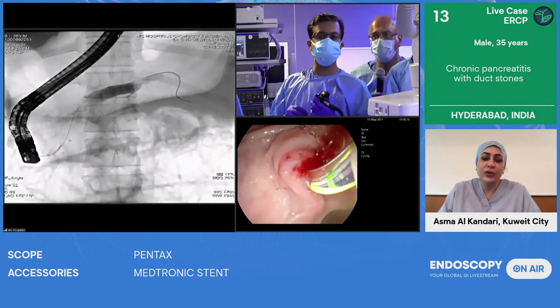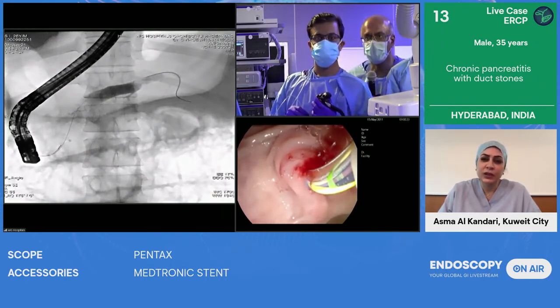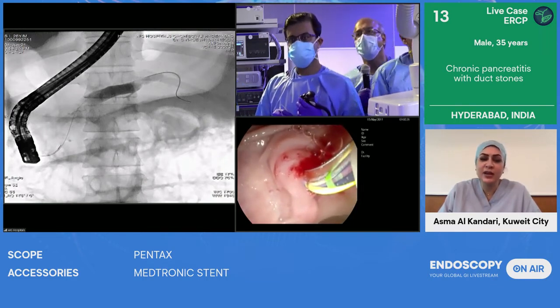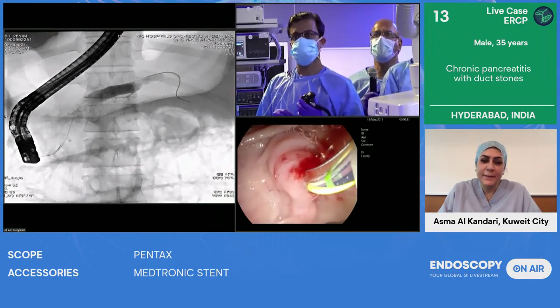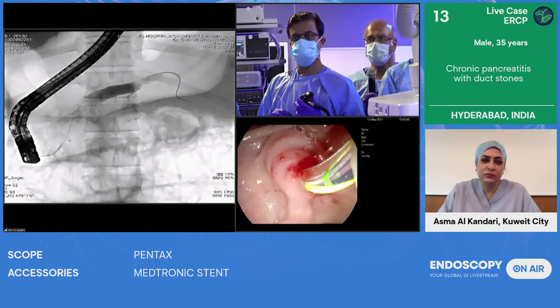So how frequently do you follow the patient with the fluoroscopy, or like every 3 months you do it to see if the stent is still there? Yeah, we would get a plain X-ray done after a month, and again repeat it after 3 months. So we'll know that the stent is dissolved. If you have a good fluoroscope, if you have a good X-ray, that is good enough. But you can also, of course, do fluoroscopy.